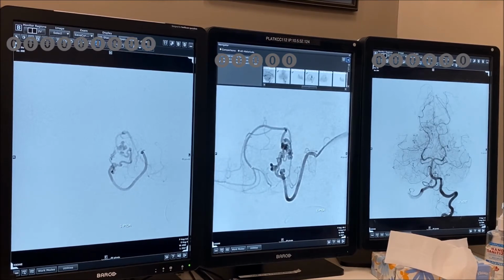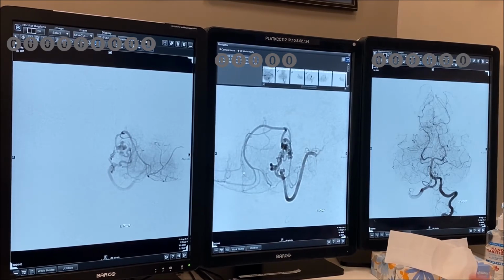It's a fair size territory, right? What territory is this? Tissue-wise. What is this? It's not brainstem. It's like a cerebellar hemisphere. So a stroke here is not so terrible. It's better not to have it, but it's not so terrible. So okay, now I get a better idea. Definitely this is a dysplastic segment. Look at this sausage here, right?